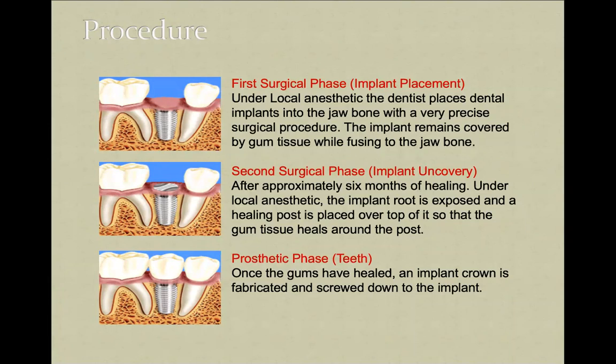If you're waiting more than 3 months for the mandible, more than 6 months for the maxilla, it is good. But if you're doing that very rapidly, it's not good. You might be lucky, it might be a kind of fortune, but just make everything standard. Just make everything according to the protocol, because this protocol was designed according to maybe millions of dental implants that were placed up to date.